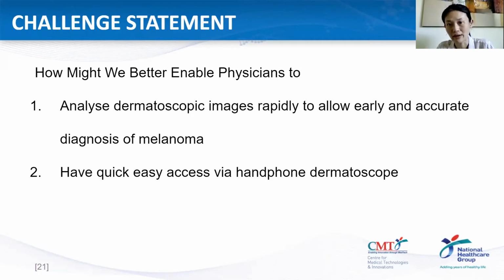Currently on the market, there are handphone dermatoscopes available, but very limited and very fixed to only certain models. And of course, the imaging may not be great. So we're actually looking at coming up with a versatile handphone dermatoscope that can attach to all handphones and of course with good imaging capabilities. Okay, the next slide please.